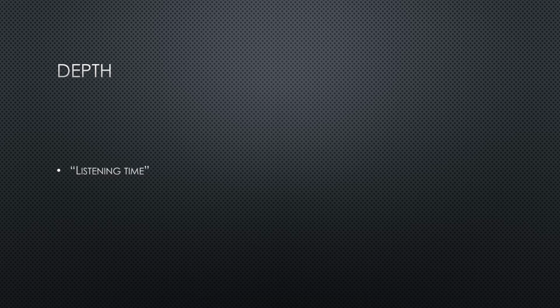So it can take, okay, I set this pulse out, I got the signal back at X number of milliseconds, it plugs it into an equation, uses that speed as the speed of sound, and goes, okay, this will be 1 centimeter deep, or this will be 1.1 centimeters deep, or this will be 2 centimeters deep. So it uses that to tell where it puts it on the screen. So it's the length of time from when the pulse goes out to when it gets a reflection back that determines where it draws it on the screen.